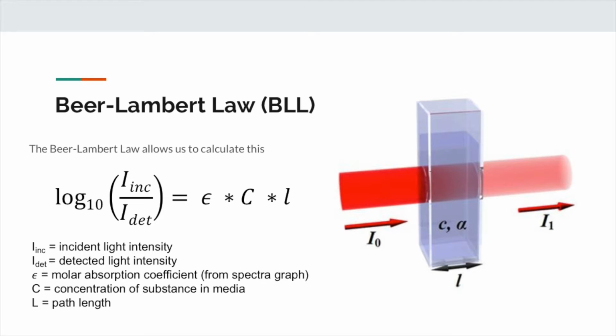Right. So the Beer-Lambert law is what basically our whole concentration calculation is based off of. It allows us to calculate the amount of light or the concentration of a medium, etc. And it essentially models incident light passing through some amount of medium at some concentration and some length, called the path length, and then the detected light coming out is a part of the equation too.